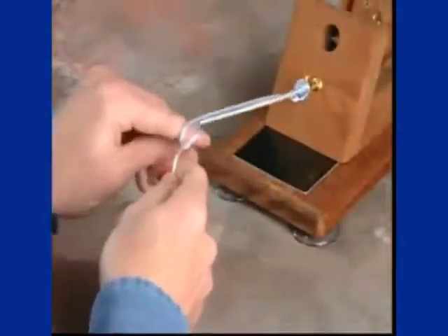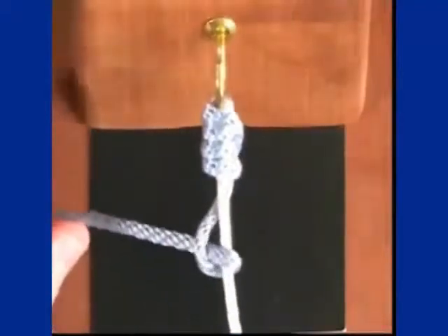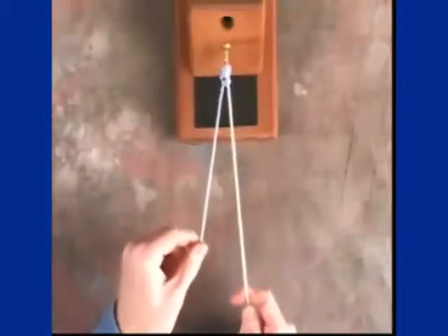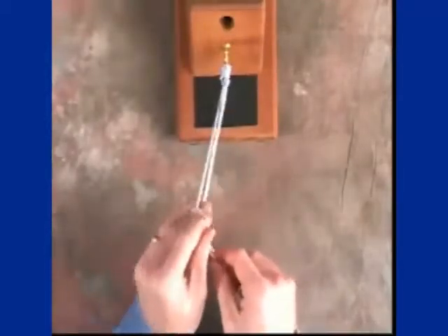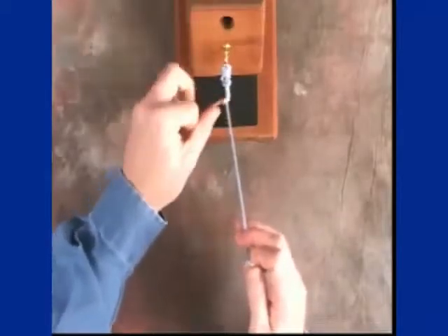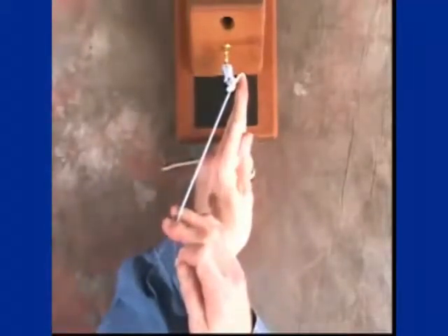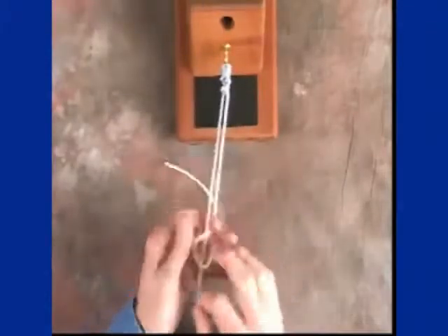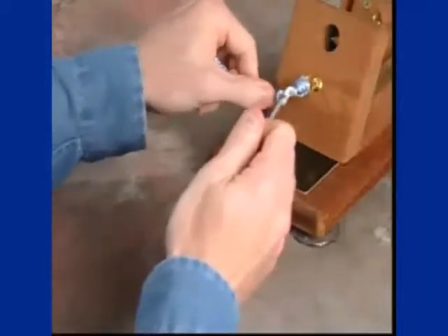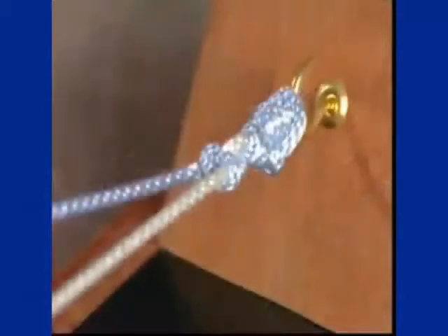Maintaining tension on your post, an initial overhand throw or underhand loop is placed on the post limb and tightened down into the joint with past pointing. The post and loop limb are then switched, and on the new post, an underhand throw or overhand loop is placed and pushed down into the joint with past pointing. This is followed by switching the post limb again and doing a final overhand throw on the new post limb, tensioning this with past pointing.